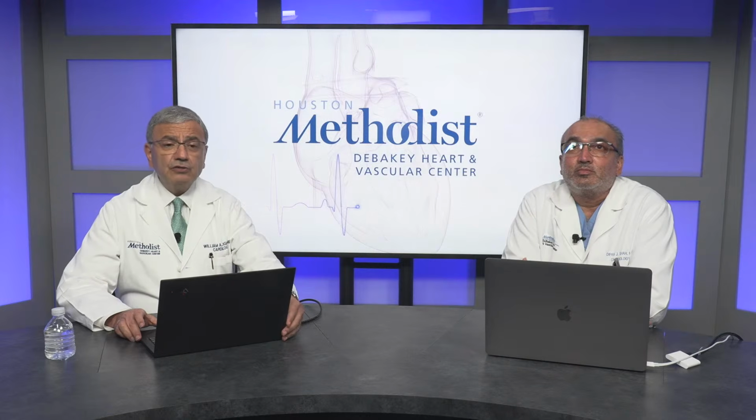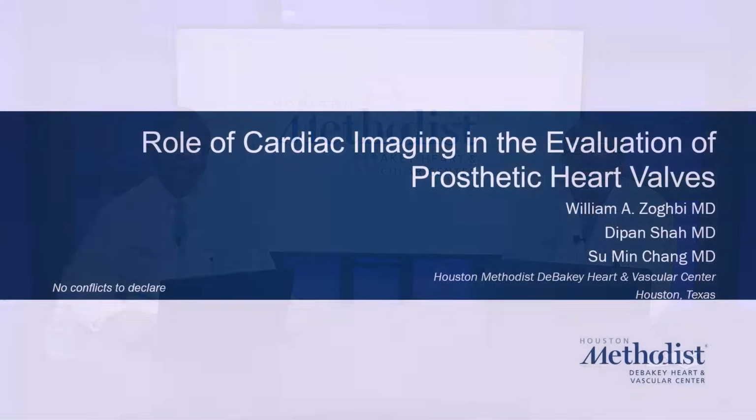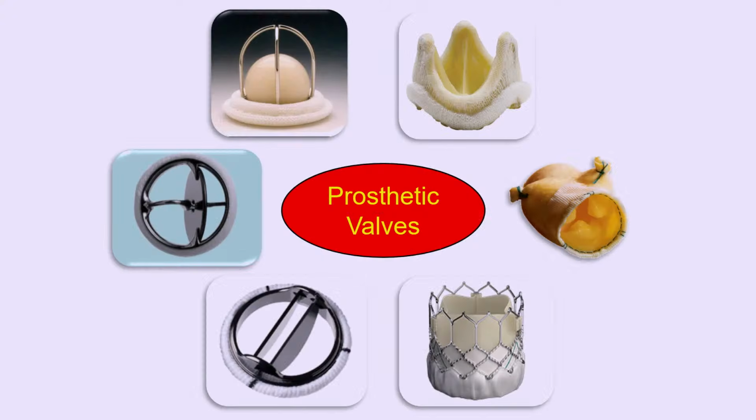So the topic is very germane, certainly to all clinicians, in addition to imagers, because prosthetic valves are certainly very prevalent. And we see them in the echocardiography laboratory almost daily, and I'm pretty sure in all areas of cardiovascular imaging. So without further ado, I will start with the echo Doppler evaluation. Dr. Shah will address cardiac MRI, and Dr. Min Chang the role of CT in these clinical situations.